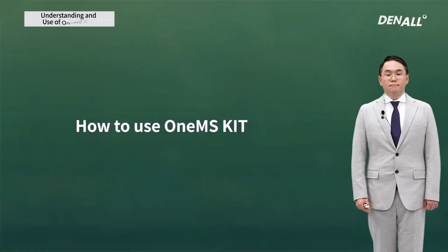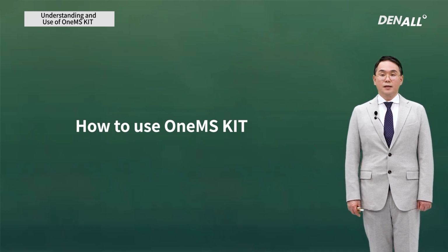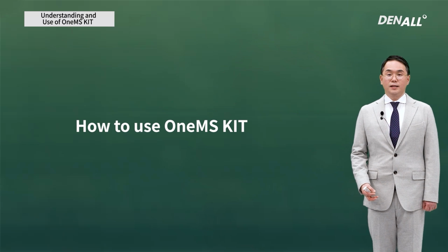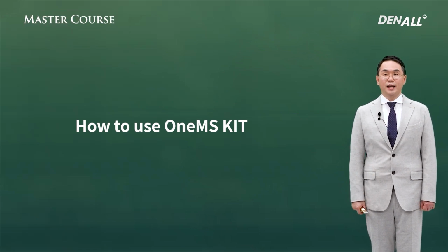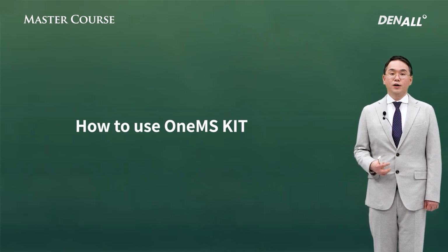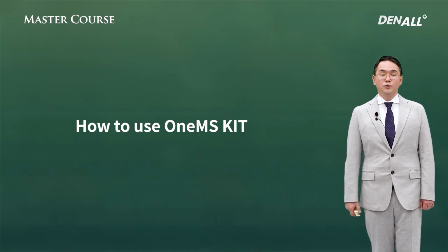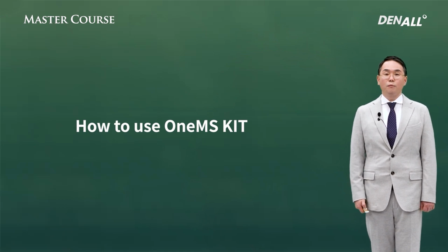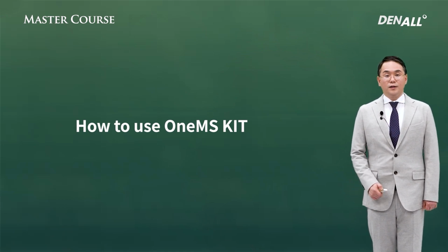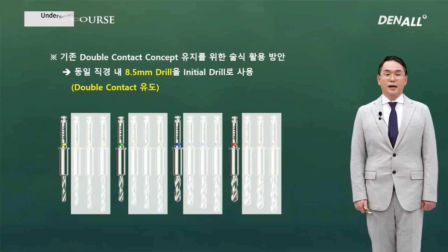The OneMS kit drilling sequence is very simple, like a one guide system. To place a 2.5 millimeter diameter MS implant, up to a 1.8 drill can be used. In most cases, you can use a drill up to 0.7 millimeter minus the diameter of the MS implant to be placed. Then you don't need to use many drills. For a guided surgery, you need to adhere to this principle.